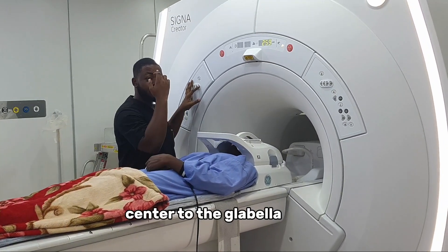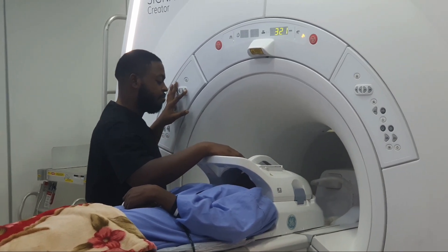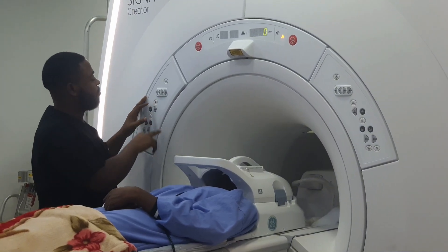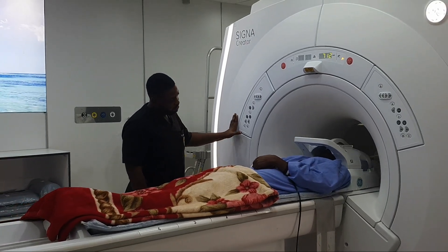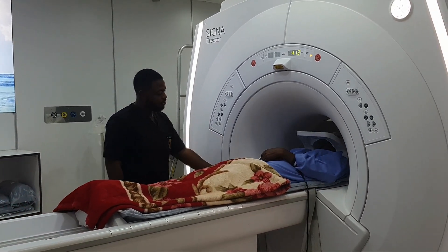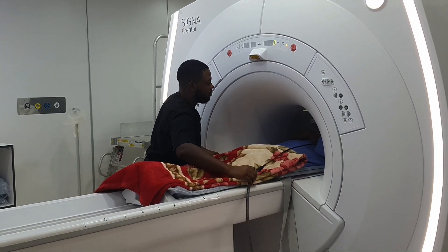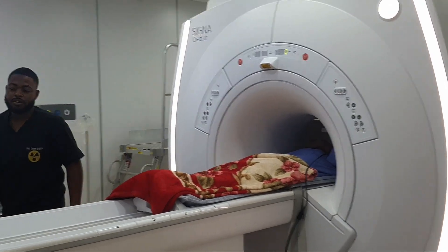We are going to the center of the scanner over here. So we are done positioning her. Right now I am going to register her details and then I am going to commence the examination.